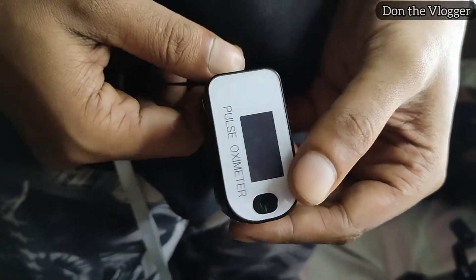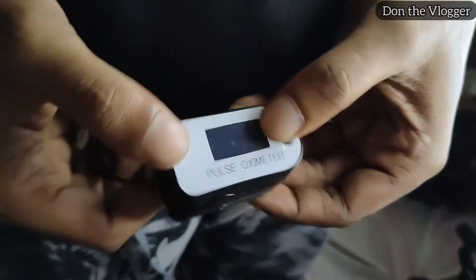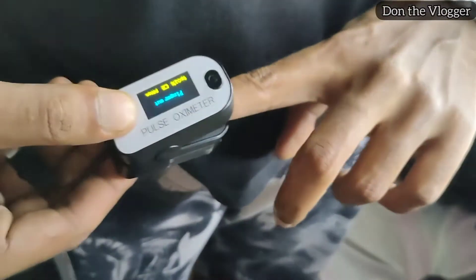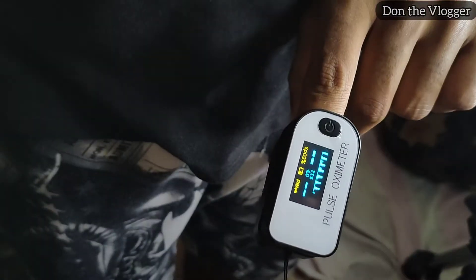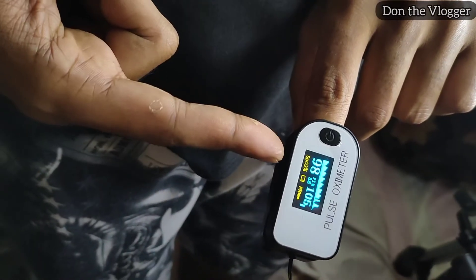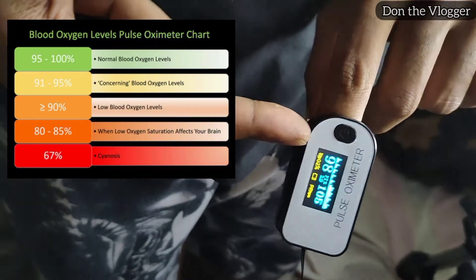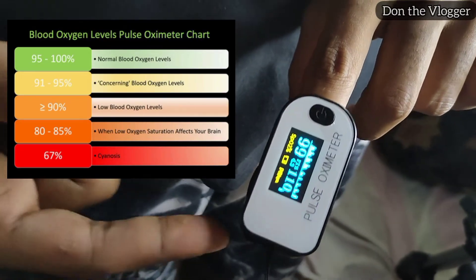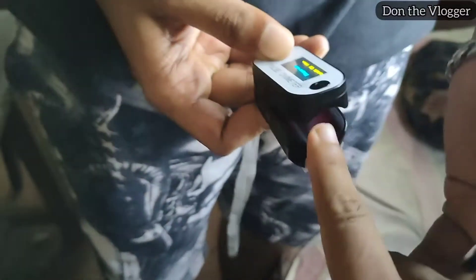Guys, this is the pulse oximeter. Let's use the pulse oximeter. If we put the pulse oximeter on, let's check the oxygen level. We can check the oxygen level — let's take a look at the camera.